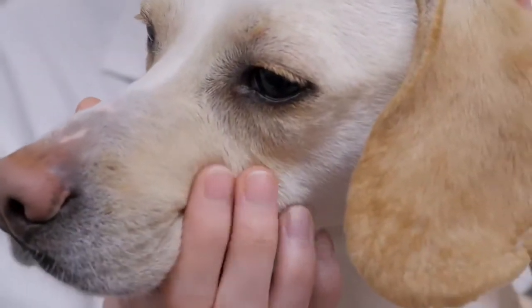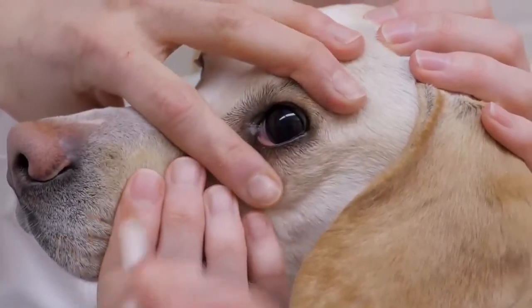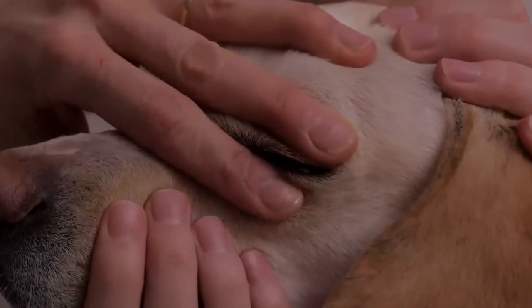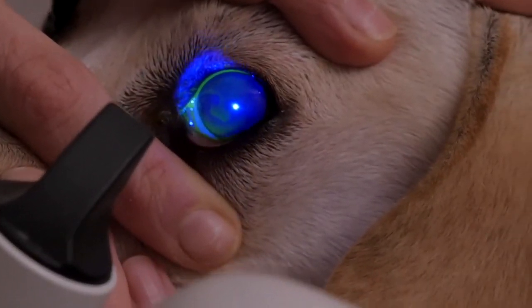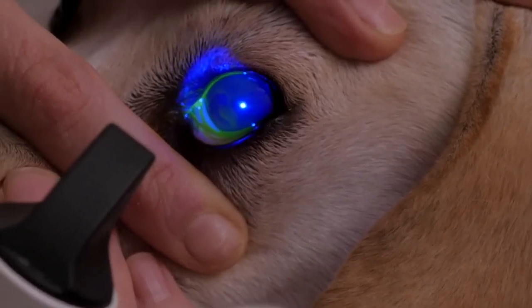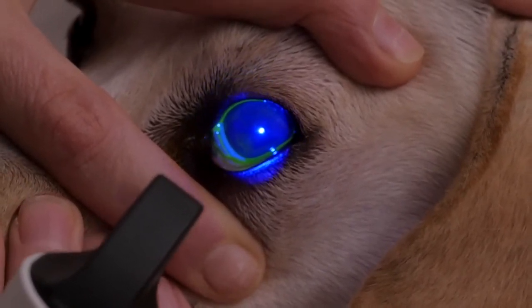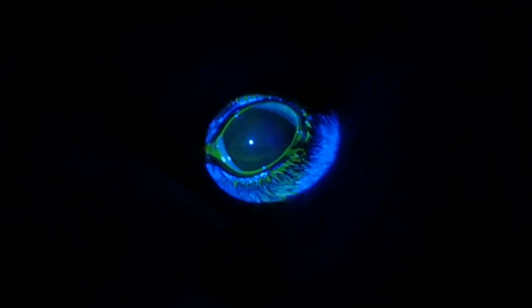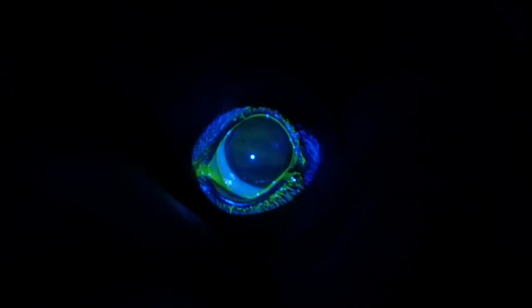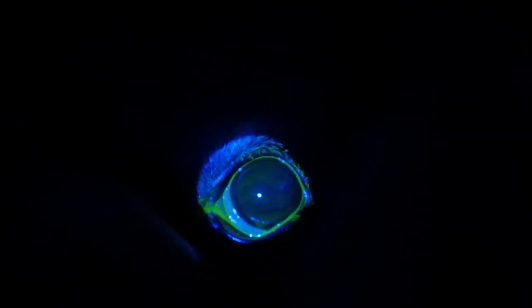Tear film breakup time. The tear film breakup time is an assessment of tear film quality versus quantity, which is assessed with the Schirmer tear test. To perform this test, the clinician applies a drop of concentrated fluorescein stain onto the cornea and immediately closes the eyes to prevent blinking. Using the blue light from a biomicroscope or direct ophthalmoscope, the eyelids are opened, and the time is recorded from lid opening until the thick green stain, i.e., the stained tear film on the cornea, is observed to break up or evaporate. This breakup is observed as dark spots appearing in the otherwise green stain. The normal tear film breakup time in the dog is reported to be 19 to 20 seconds.